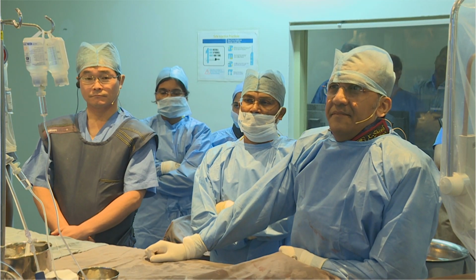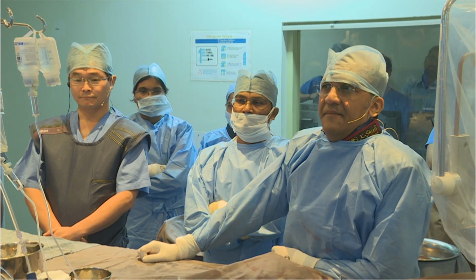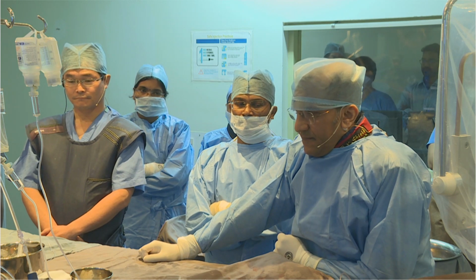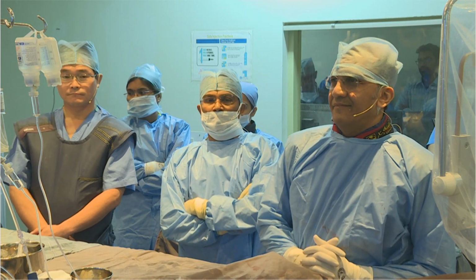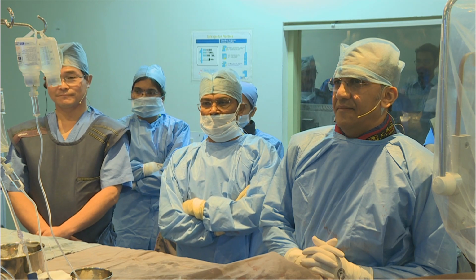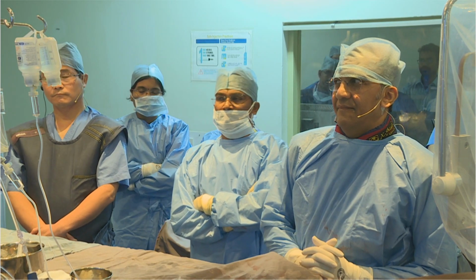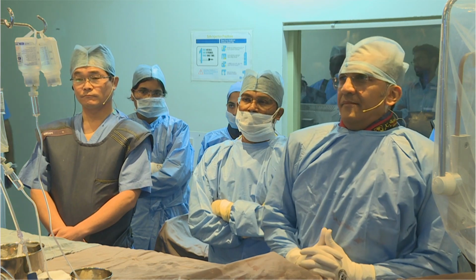Ostium or bifurcation. In my opinion, in this case, I would use an IVUS run both from LAD back into left main and circumflex back into left main. And then I would talk about whether it is significant or not significant, which lesion. So would you base it on physiology or would you base it on imaging? Right. In this case, we can say that it's a moderate lesion of the left main bifurcation. We don't have the full data at the moment with us. So in many cases, I combine both. Yeah, sure. So I think that's what Kirti has in mind.